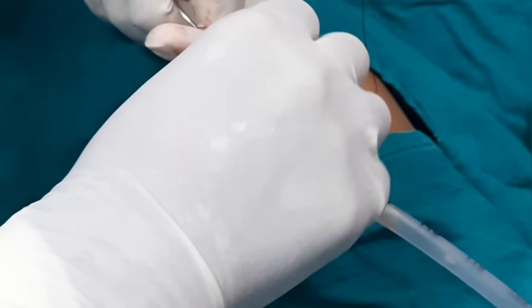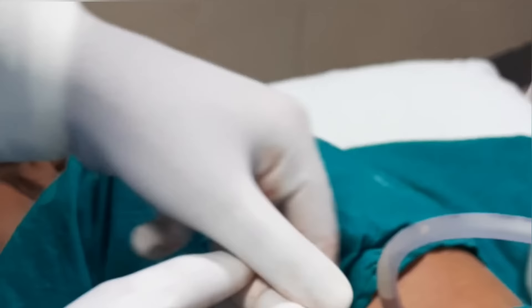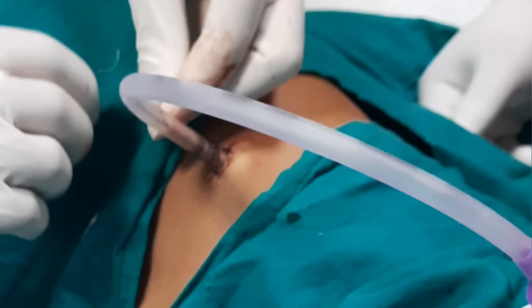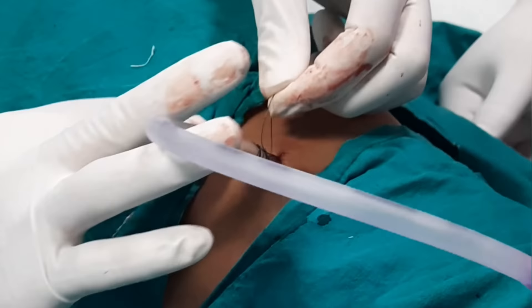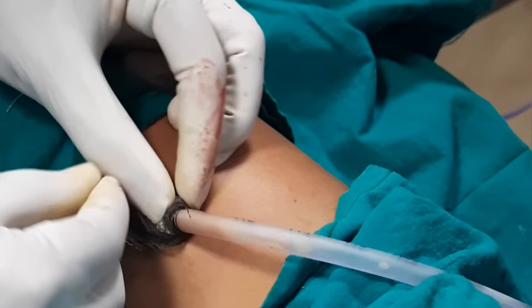Different surgeons put sutures differently — some use a purse-string suture, others use different techniques. There is no proven advantage of one suture type over another. You can see we are tying the knot to the chest tube. We then take a gauze piece with betadine and place it over the chest tube site.